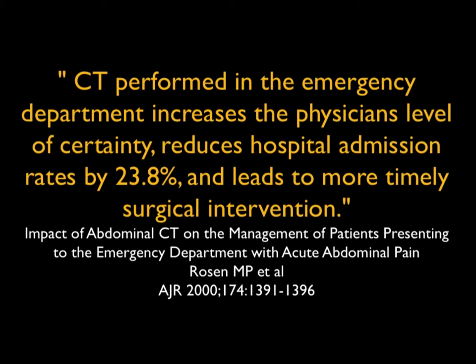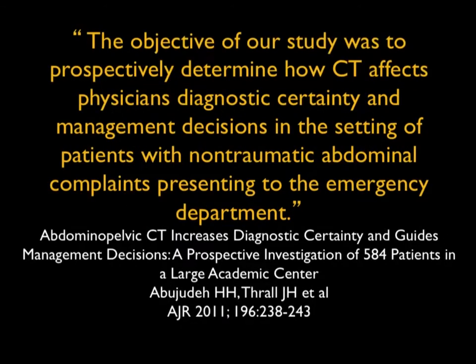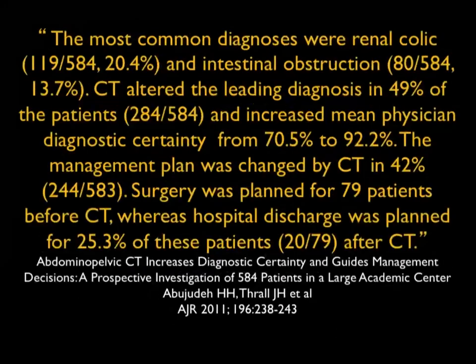Surgery was planned for 79 patients before CT, while after CT, 25% of these patients were discharged. So now you're looking at better diagnoses, more certain diagnoses, and patients who might have gone to surgery with a negative laparotomy don't go to surgery at all. So the ability to get the right answer becomes very critical.